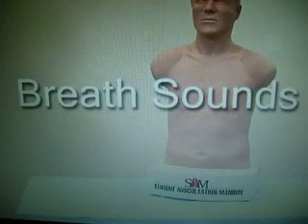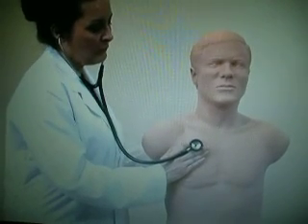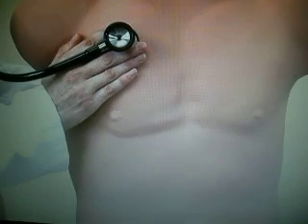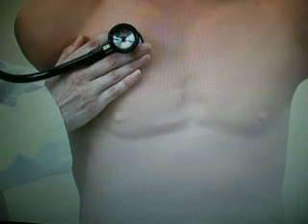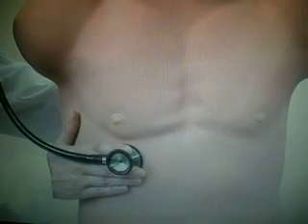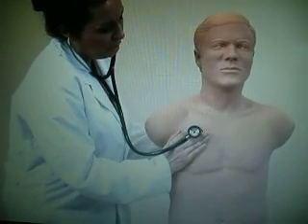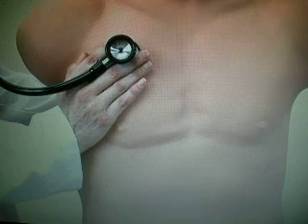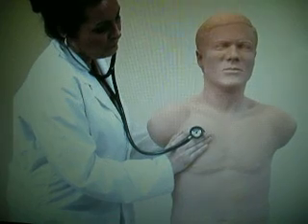Breath sounds are easy to hear with SAM. Place the stethoscope on the upper lung and listen to very coarse crackles. To illustrate diminished lower lung sounds, place the stethoscope on the lower lung. Move the stethoscope back to the upper lung and hear at normal volume. Lower lung sounds can be normal or diminished without changing the upper lung.